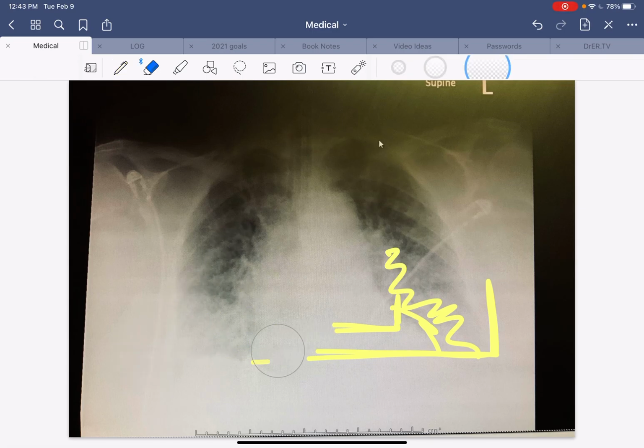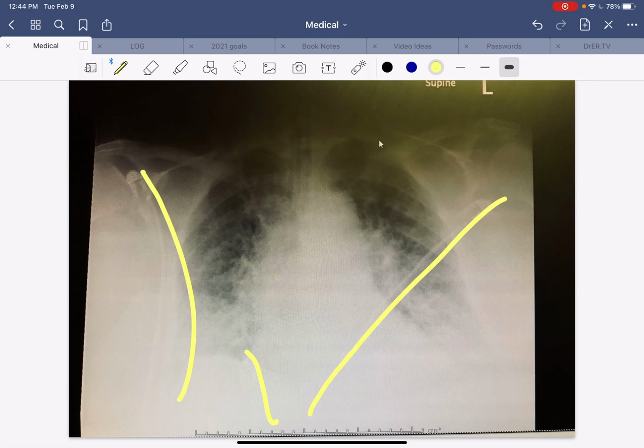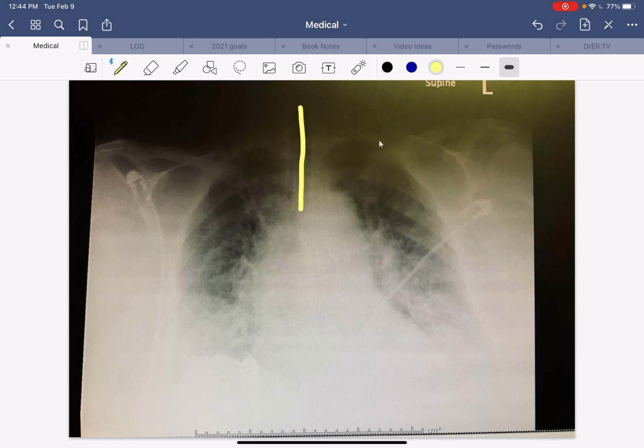So, grossly abnormal x-ray. The other things: there are wires present here, there are monitors, this is a sicker patient currently on a monitor, and things like that. And lastly, the other thing you should be able to notice, well, you notice because I know what's wrong. You can see a little thing right here, and that's the airway, right? The trachea, which we saw in the second video.